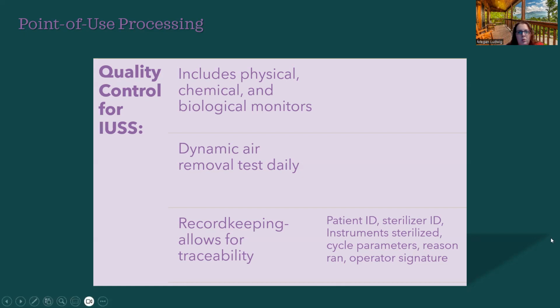This might be in a logbook, or it might just be right next to the machine. The sterilizer ID, what actually was being sterilized, you're going to want to make sure you have all this so you can track it if need be in your signature.